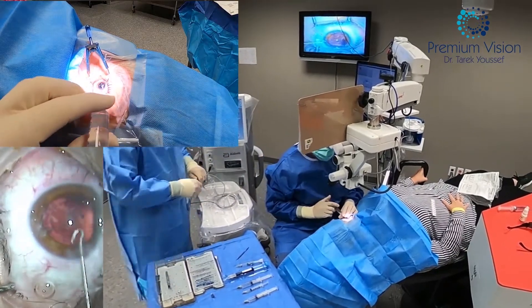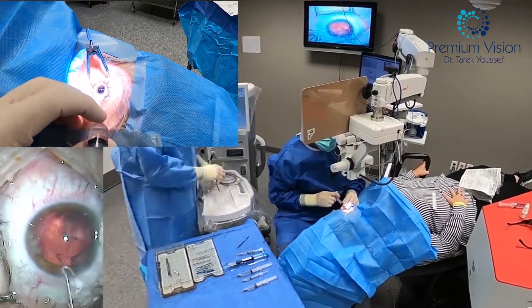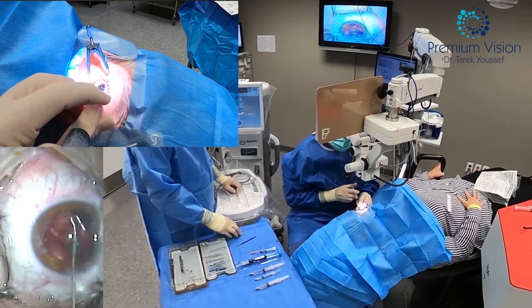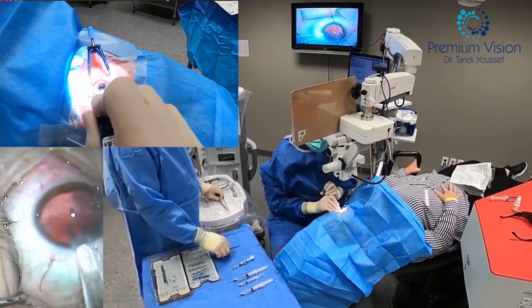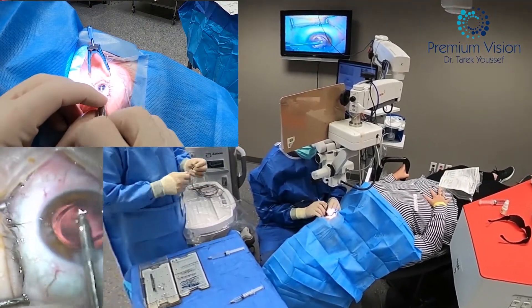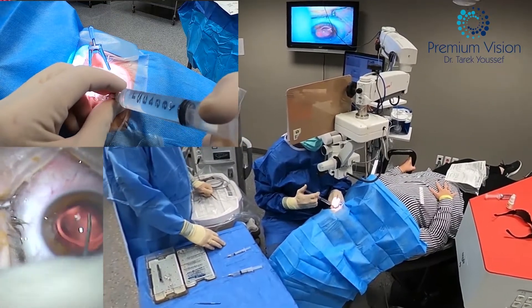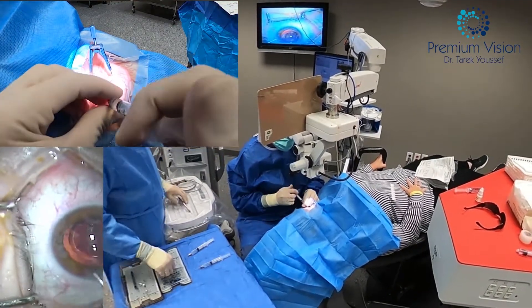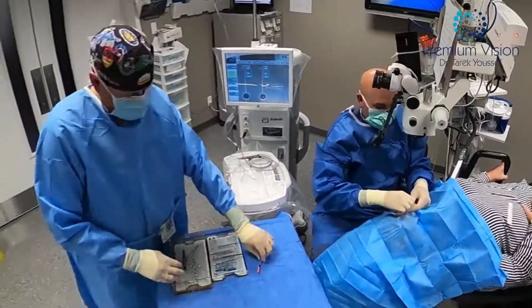The nucleus is removed. J-Canula cortical cleanup. Got a refill of J-Canula — never run out of fluid in J-Canula, otherwise you're going to get in trouble. The lens is implanted, which is the Eyhance DIB00 from Johnson & Johnson, in blended vision format. BSS wash, hydration of wounds, dropless injection. And we're all done.